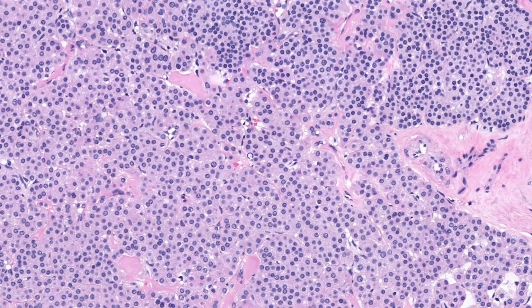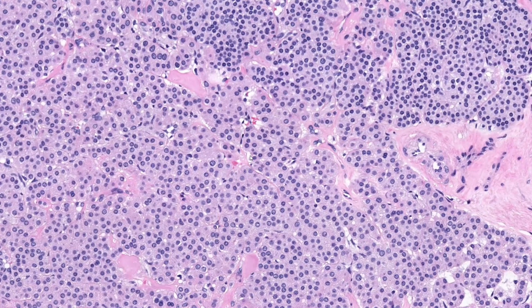At high power, these cells have scant amphophilic cytoplasm with distinct cell borders. The NC ratio is high, and nuclei are round and centrally located, with fine chromatin and one or more punctate nucleoli. In some cases, this produces a salt and pepper-like chromatin pattern. This is an example of a glomus tumor, a usually benign neoplasm of modified perivascular smooth muscle cells. Most cases arise in the skin as a tender, bluish-colored lesion.